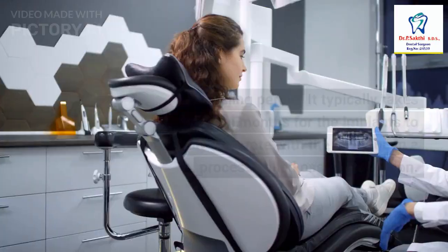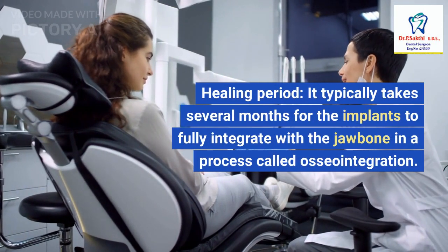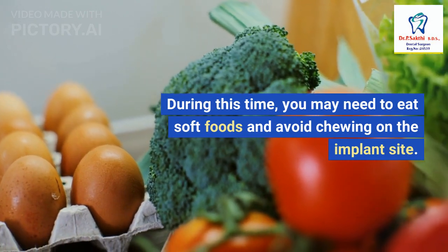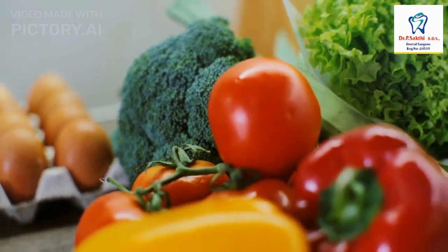4. Healing Period: It typically takes several months for the implants to fully integrate with the jawbone in a process called osseointegration. During this time, you may need to eat soft foods and avoid chewing on the implant site.